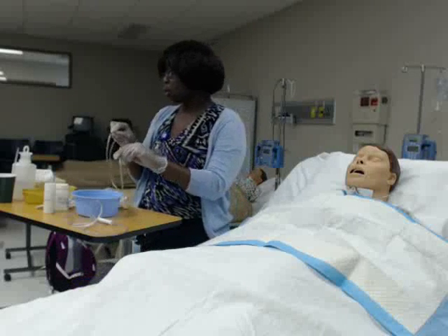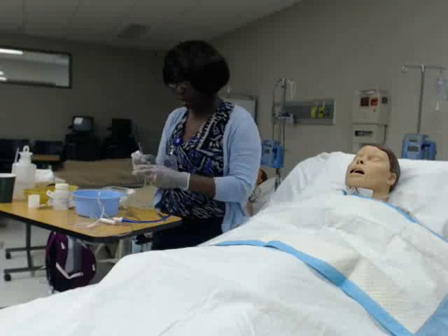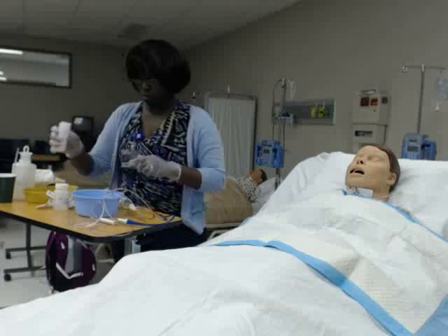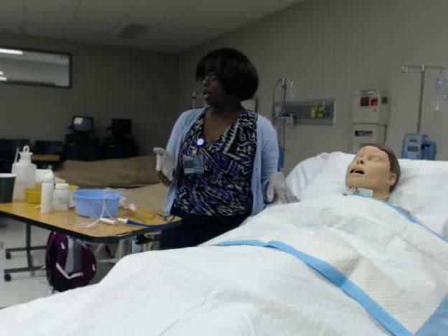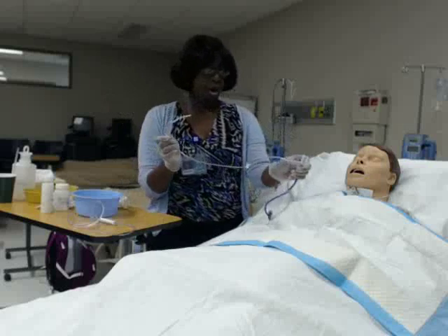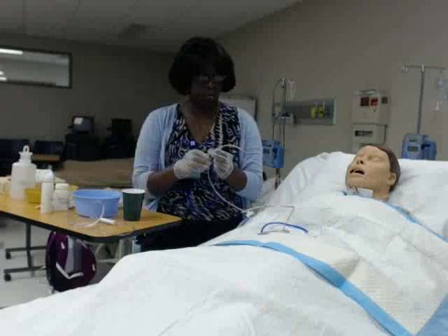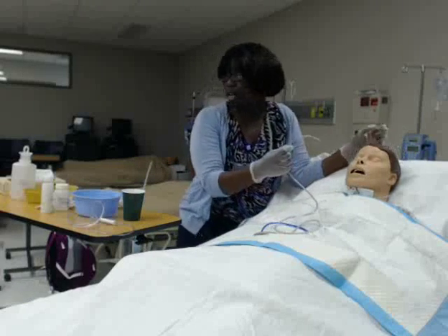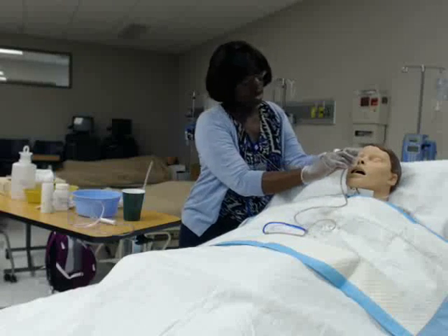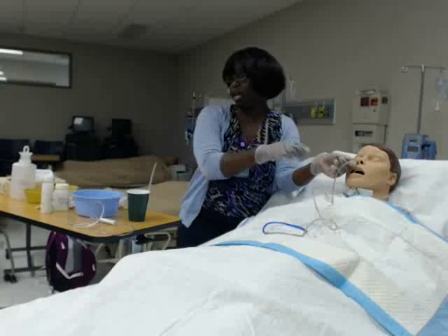At this point you'll sit your tubing in lukewarm water or apply your lubricant. I'm going to go ahead and spray this — you have to spray it to insert into the mannequin. I'll explain to the patient that I'm going to start inserting. I want them to hyperextend their head back a little to start — that gets the first five centimeters in. Once you're past that, you'll start hitting the gag reflex, and that's where you want them to take a small sip of water. As they're sipping and drinking, you continue to advance.